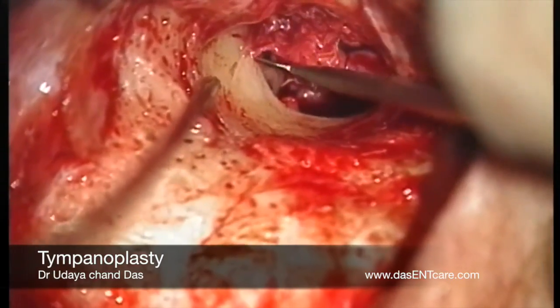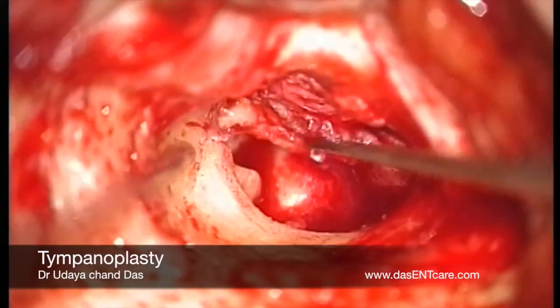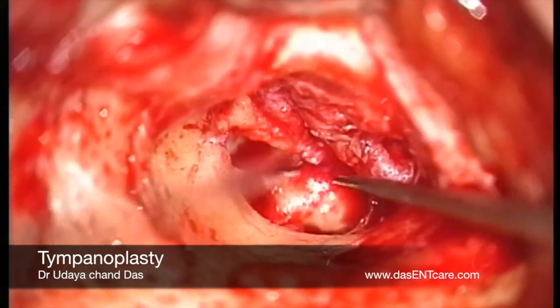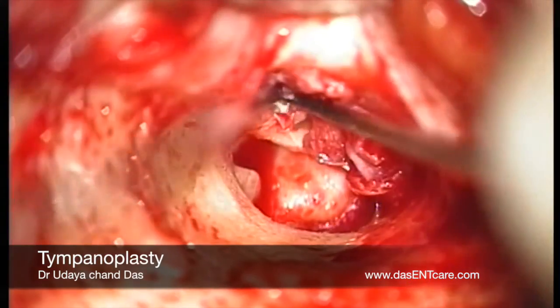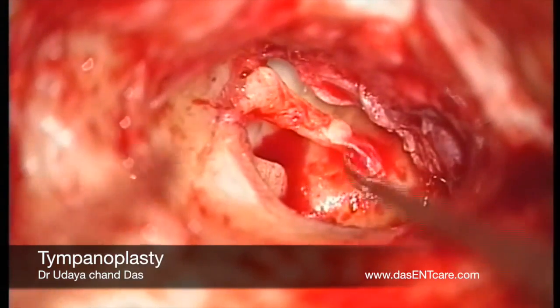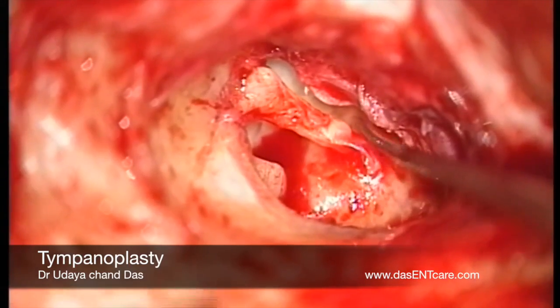Once the eardrum is elevated over the handle of the malleus, the handle of the malleus is denuded of all the tissues. Care must be taken not to leave any epithelium onto the handle of the malleus. Once the whole handle of the malleus is exposed, it is inspected, the handle is moved and the ossicular chain — that is the incudostapedial joint — is assessed.